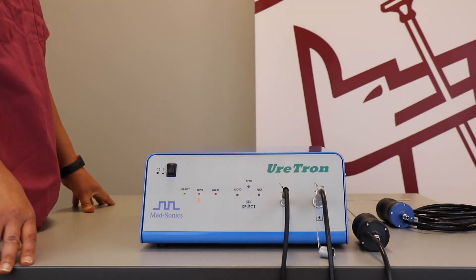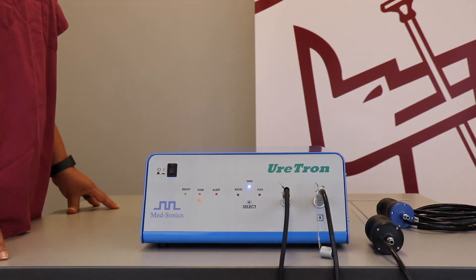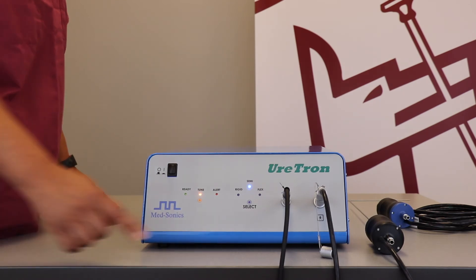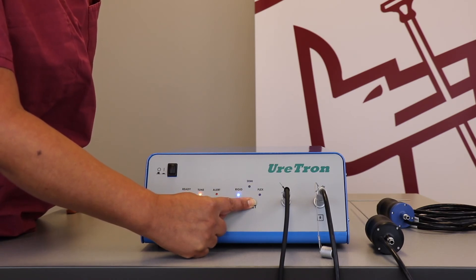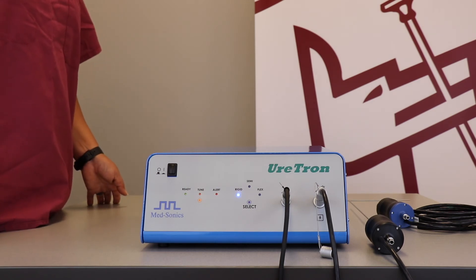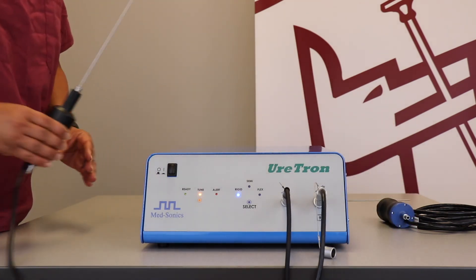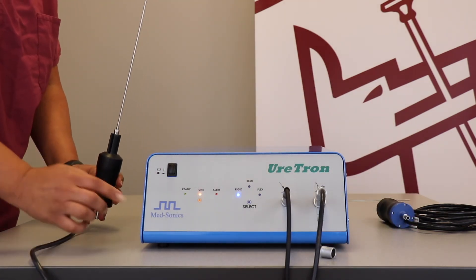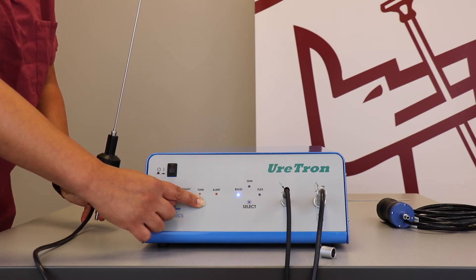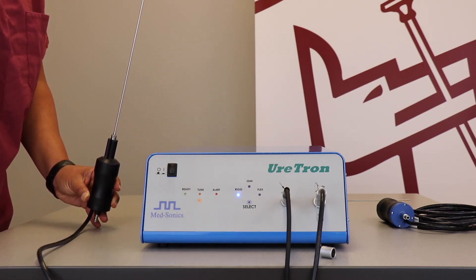After plugging in the handpiece and foot switch, you are then ready to turn on the system. After turning on the system, the probe mode is defaulted to semi. The way to change it is by holding down select for a few seconds — it will then switch to rigid. After selecting the appropriate probe mode, you are now ready to tune the device. To tune the device, you must hold it upright and hold down the orange tune button for a few seconds. You will then begin to hear the device tune itself, after which you may release your finger. It will then illuminate green, meaning that it is ready for use.